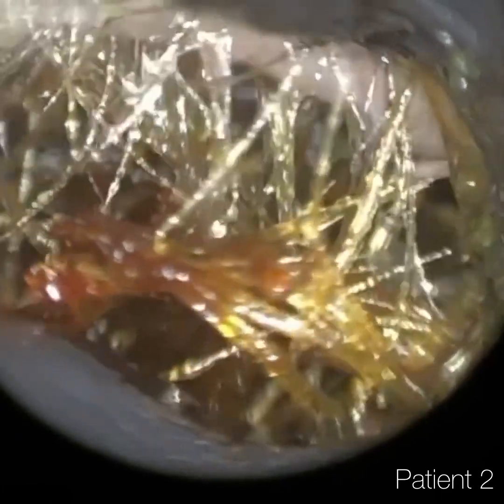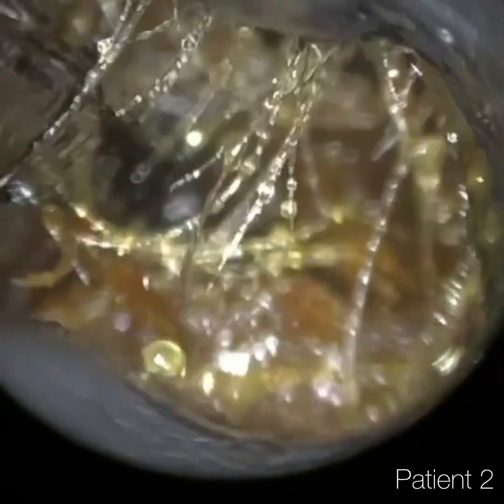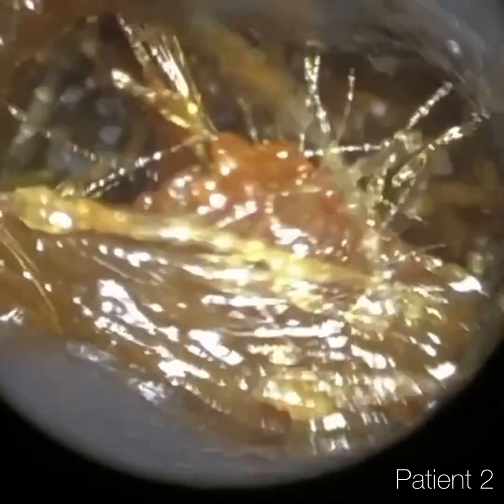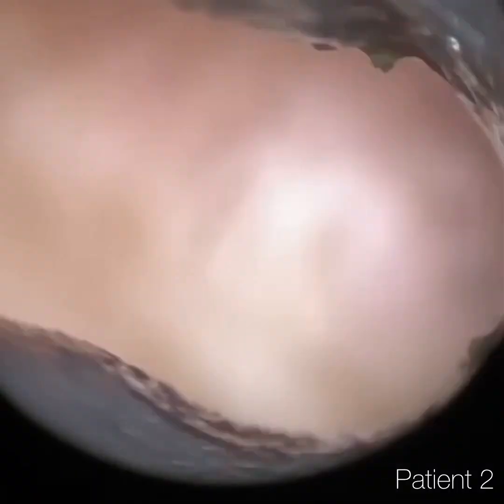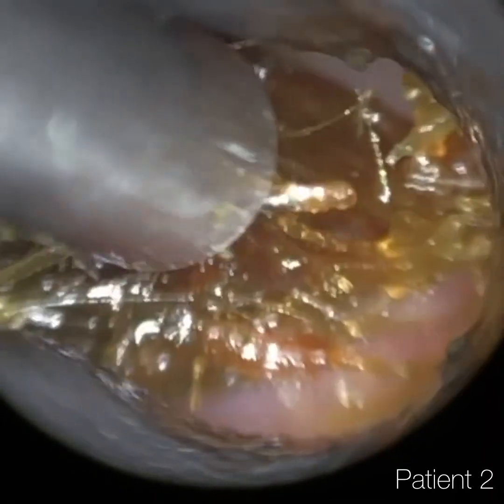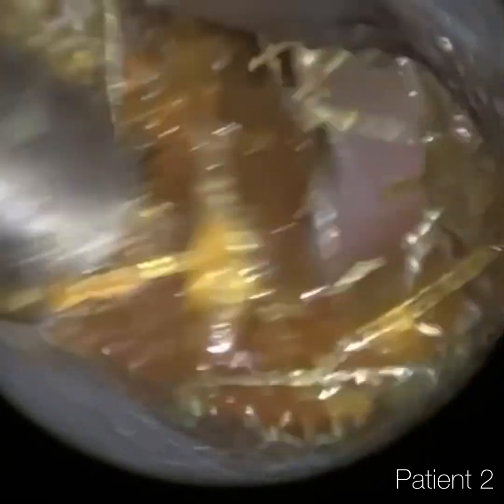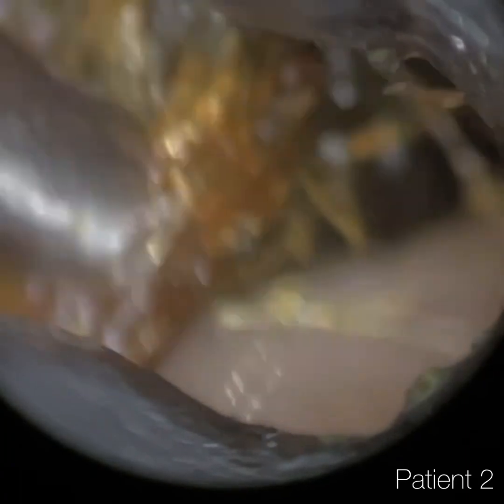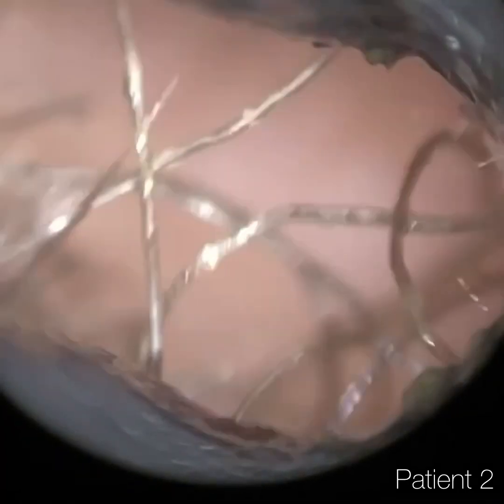Again, we've got some more hairs out. In the last week or so, I've had loads of patients with loads of hairs in their ears and matted earwax. Just using the speculum to stretch the ear open and straighten it. I've removed some of the hairs, so I'm going back in with a suction probe now. There's a big bundle of hairs that I'm removing. And I think now I've managed to remove the plug in one piece. I'm just using these little circular wriggle motions to bring the wax slowly out — that's the tip of the wax — and it's now out of the ear. The wax that's a bit further away is a bit darker, so that's oxidised. I've managed to extract that from the ear canal.